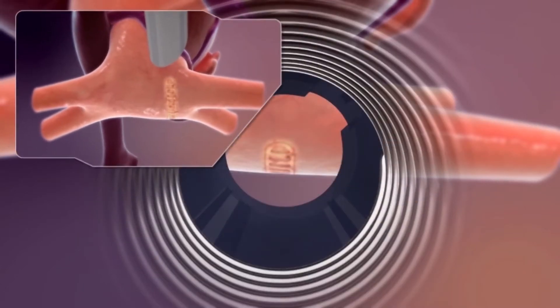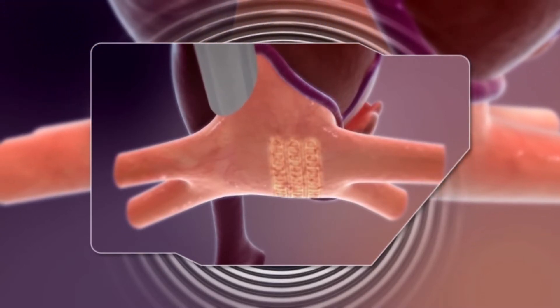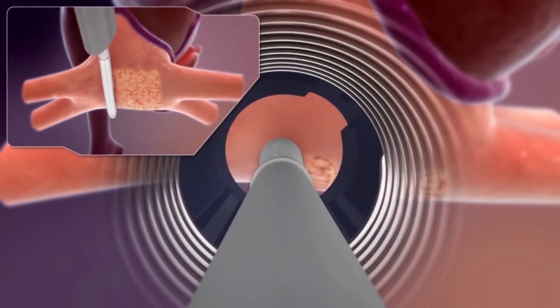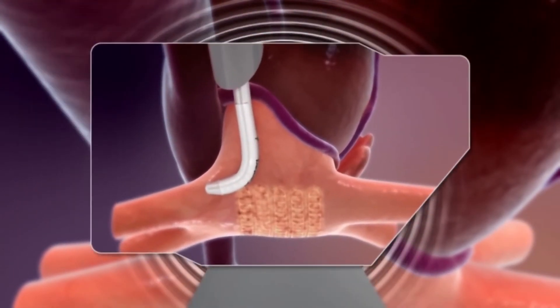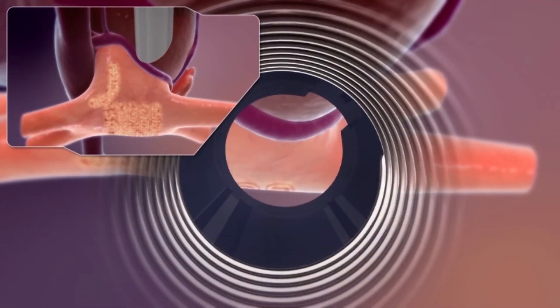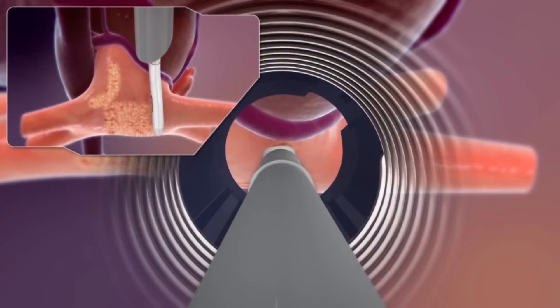This is his catheter. He's delivering ablation lesions by heating the tissue on the back of the heart. This is the left atrium and these are the four pulmonary veins. It turns out they harbor most of the abnormal electrical activity that causes atrial fibrillation.